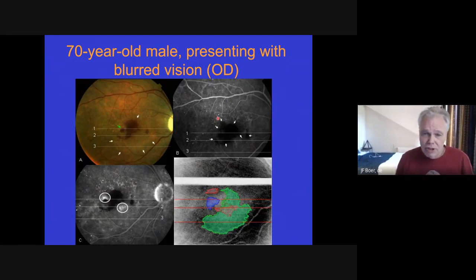What it also shows, and I go to the third image, that's this one here, is that after a long time, when the dye is actually already washing out of the blood vessels, you see that there are locations where the dye has leaked out of the blood vessels.